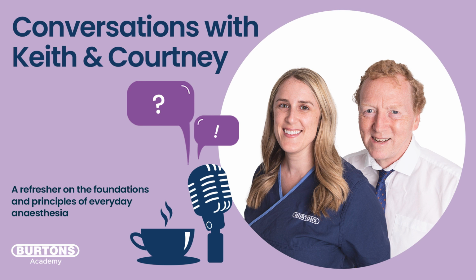Maybe first we need to think about why they need to be where they need to be and what it means. And also maybe we need to think about some other concepts like minute volume, alveolar ventilation rate, that sort of thing. But you can approach a different machine with those parameters and get going.